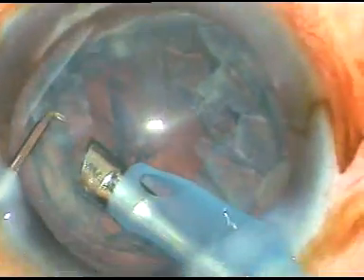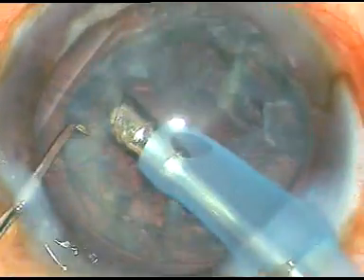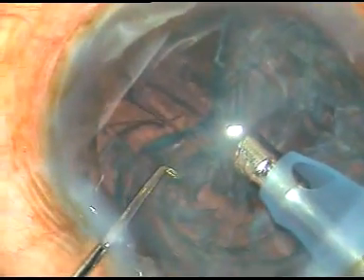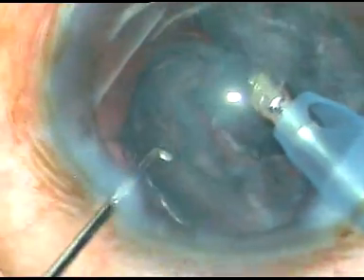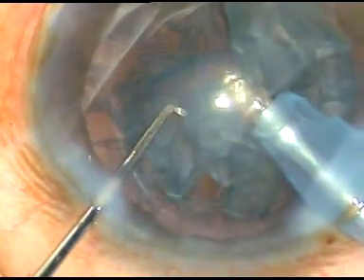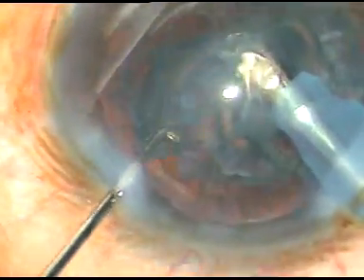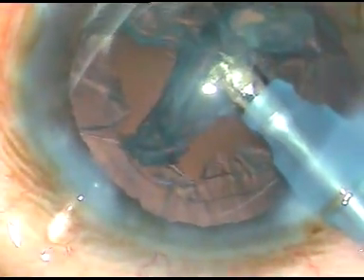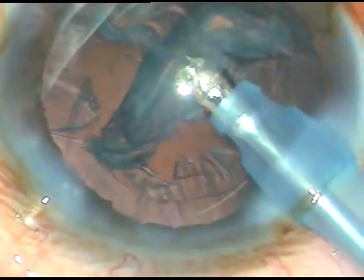So I try to engage it at 5 o'clock, and I see that there is a lot of stress on the zonule. So I try it here at around 3 o'clock, and I become successful in pulling the epinucleus out of the capsular bag, and slowly I emulsify the epinucleus.